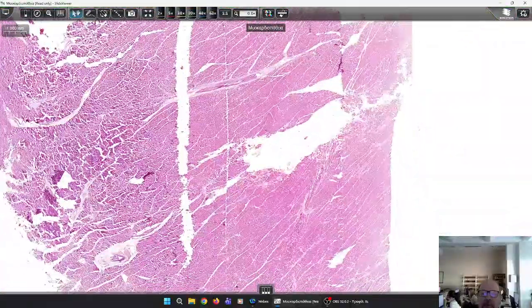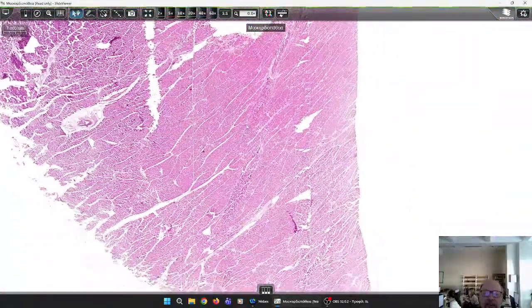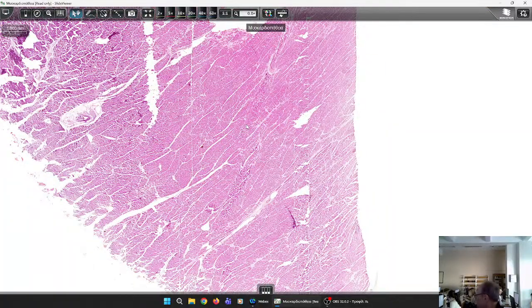However, none of these findings is that specific as the increase in the weight of the heart, which causes some sort of an asymmetrical disfiguration in the left ventricle, which as a consequence cannot be filled with blood, and then it cannot send enough blood to the periphery.